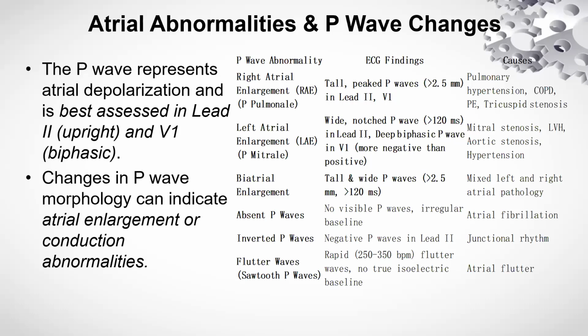I remember during our part 1 in Ibadan, they showed us this atrial flutter, and many of us failed it. But I remember a friend of mine just came out smiling and said, I saw atrial flutter, and that gave it away. So when you see the sawtooth P waves, because I know that you can be given ECG tracings to interpret, that's why we're doing this tutorial today.